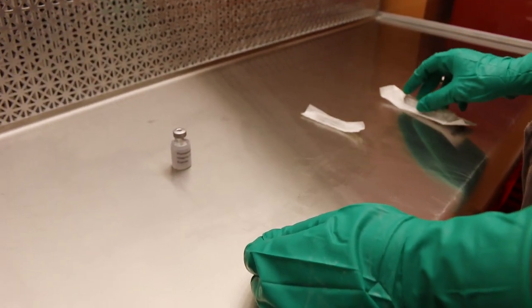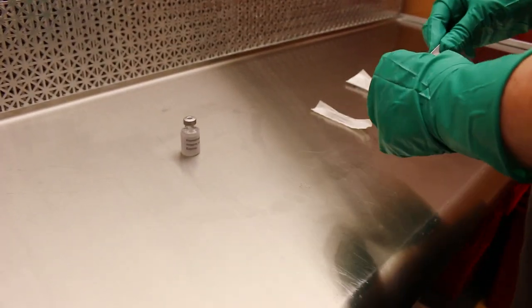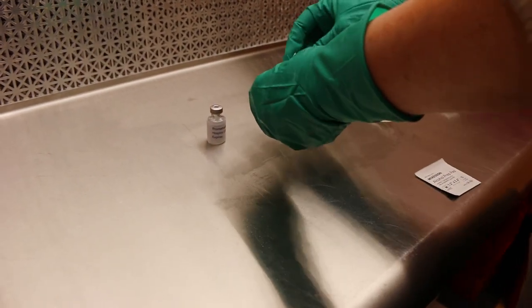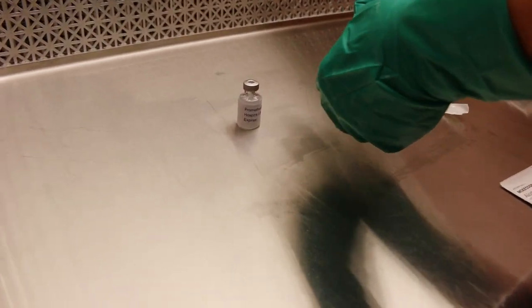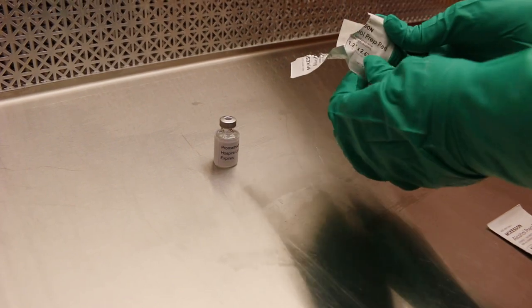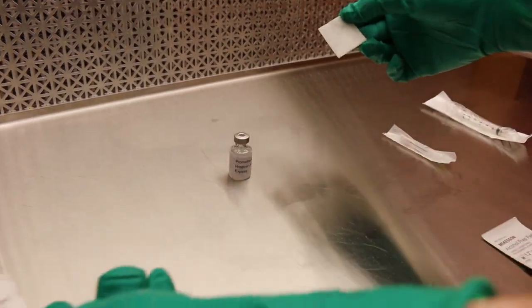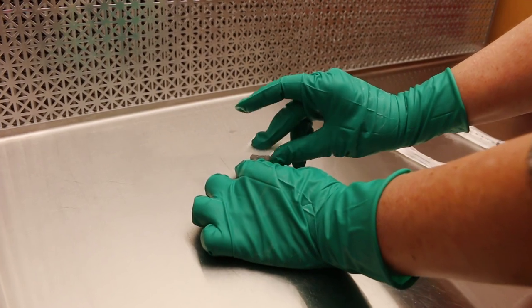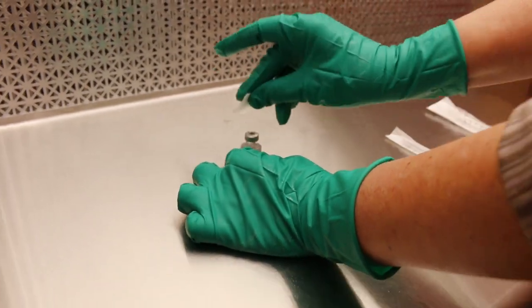Step nine, pick up an alcohol swab and place it in the direct compounding area. Open and discard the swab package in the discard pile, and swab the top of the vial, then place the used swab in the discard pile.